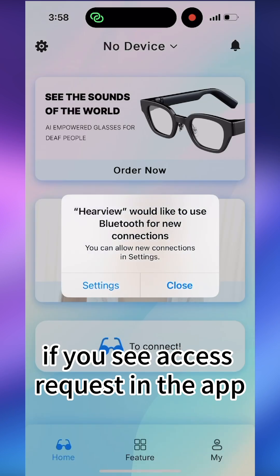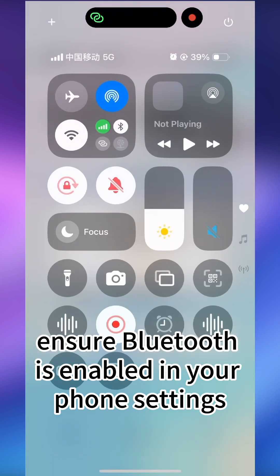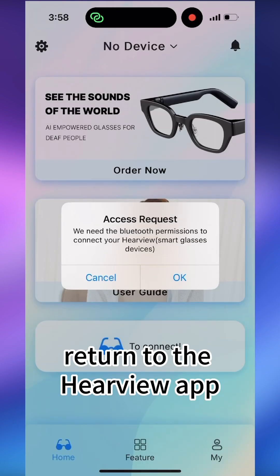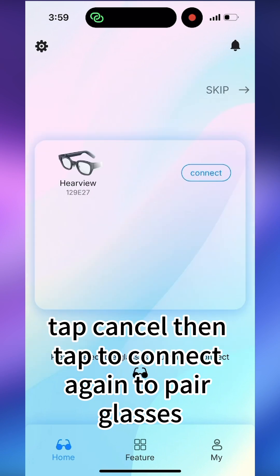Connection troubleshooting: If you see an access request in the app, ensure Bluetooth is enabled in your phone settings. Return to the HearView app, tap Cancel, then tap to connect again to pair your glasses.